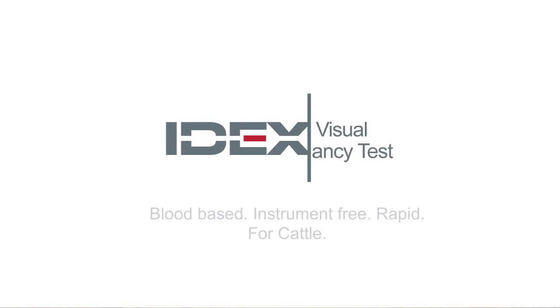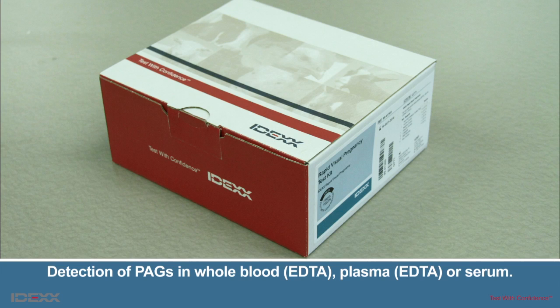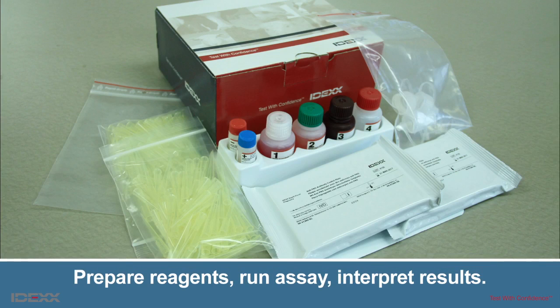Hello, and welcome to the IDEXX Rapid Visual Pregnancy Test Protocol training video. The IDEXX Rapid Visual Pregnancy Test is an enzyme-linked immunoassay for the detection of pregnancy-associated glycoproteins in bovine EDTA whole blood, EDTA plasma, or serum samples. In this training video, you will learn to prepare the reagents, run the assay, and interpret the results.